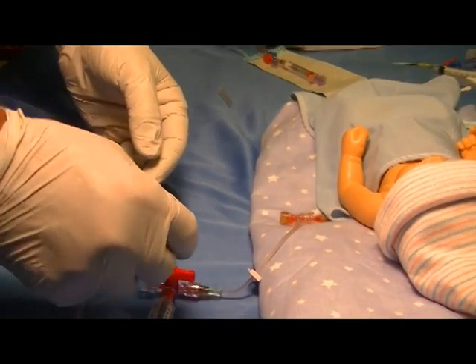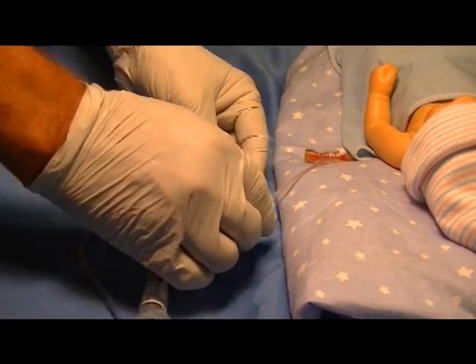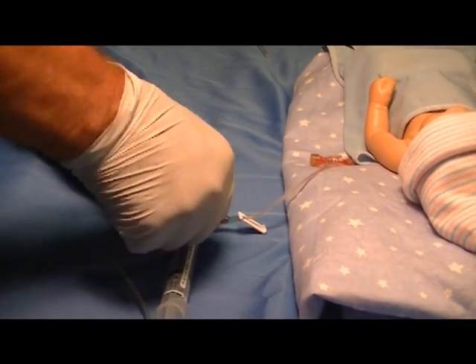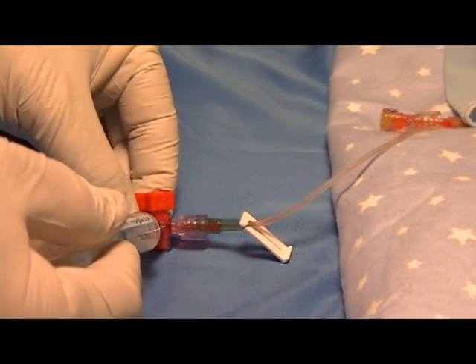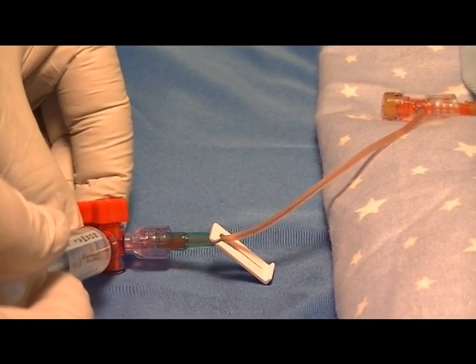Unclamp the line and go to your flush syringe attached to the T-connector, giving approximately 0.3 to 0.5ml of flush to clear the catheter.